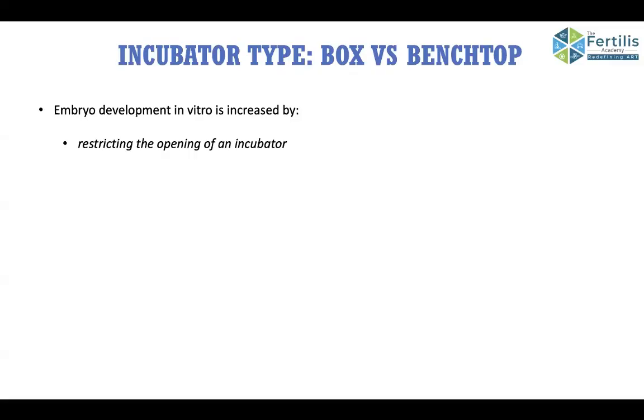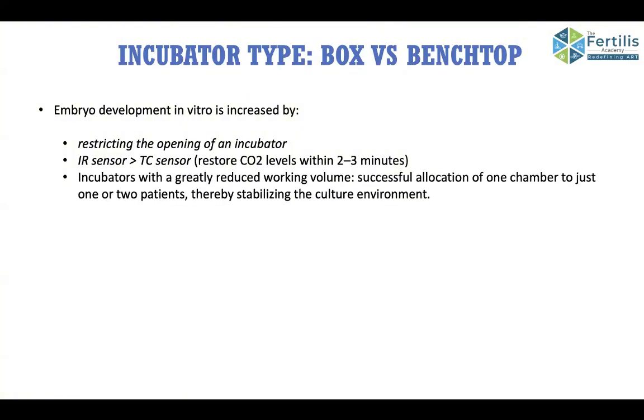Between box and benchtop incubator, benchtop incubators are preferred because of faster recovery, and also because in benchtop incubators 100% gas is supplied from the cylinders, and in the cylinder you can attach an inline filter and take care of VOCs.